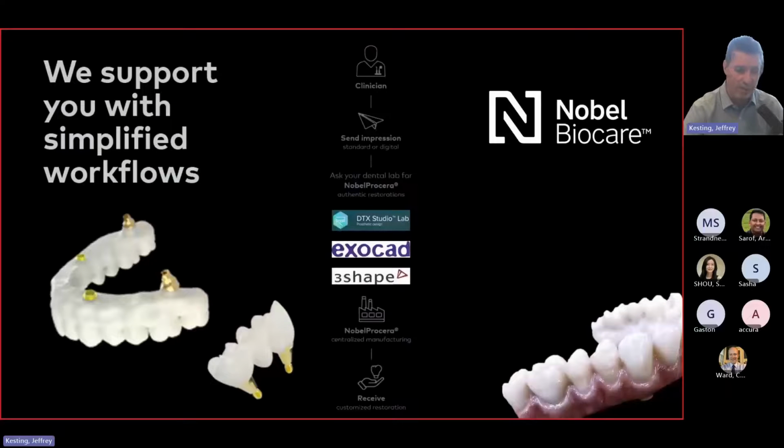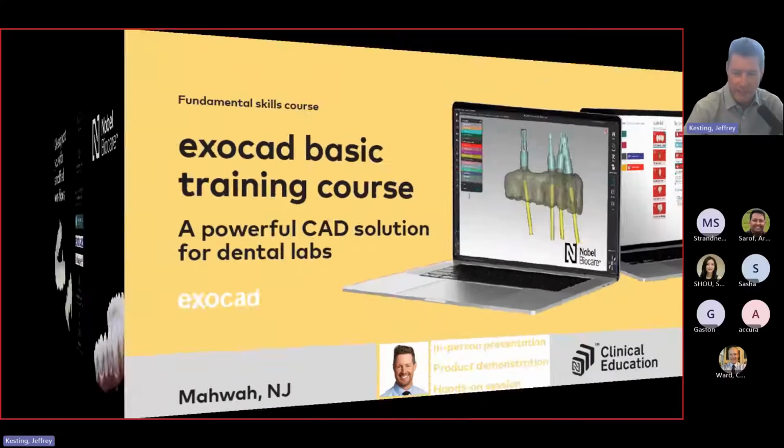So we can support you with different workflows. Of course, exocad being our focus right here, so we're able to receive those files into our manufacturing facility in New Jersey to produce those high quality restorations.